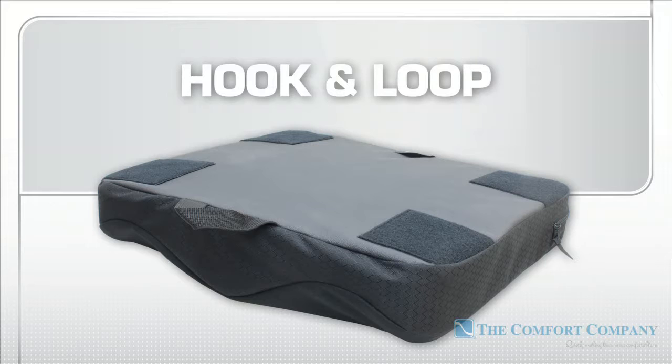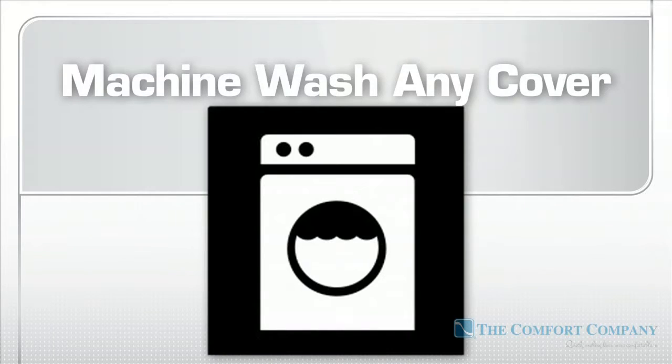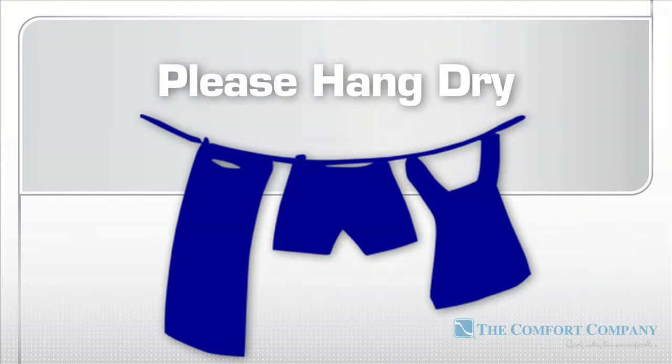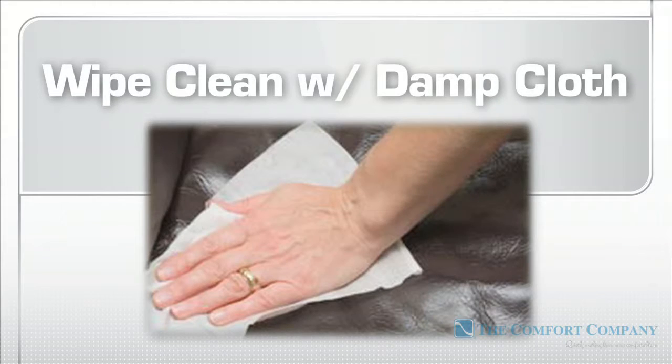Both cover options feature hook and loop attachments, non-skid bottoms, and are machine washable in cold water with any laundry detergent. Please hang dry. For a quick cleaning, leave the cover on the cushion and spray with any disinfectant cleaner, then wipe it clean with a water-only damp cloth.